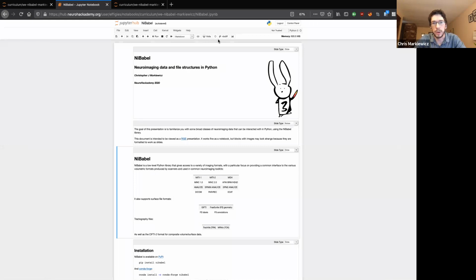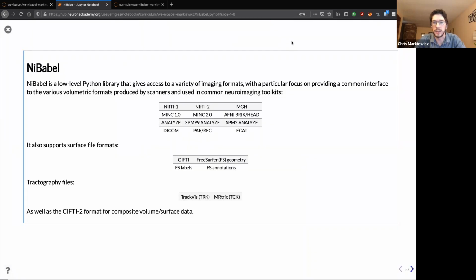We're in a normal Jupyter notebook, and then there's a little graph thing here. So you can open that, and we're back in this slideshow. So feel free to follow along however you want. Sorry, I need to move so that I can see my slides.